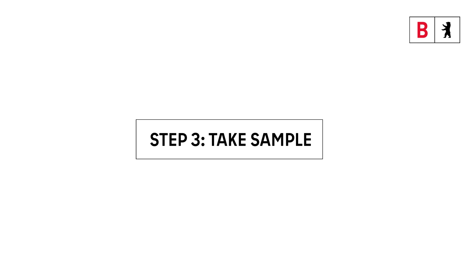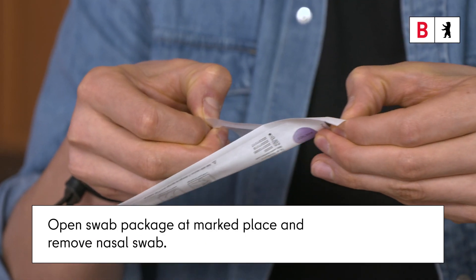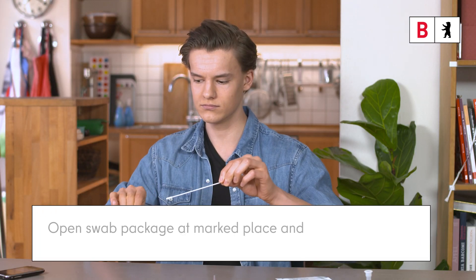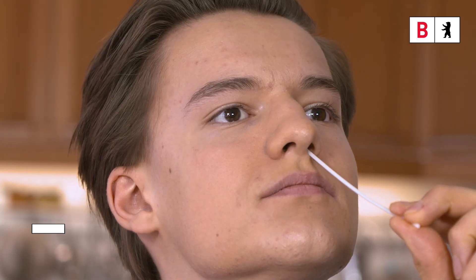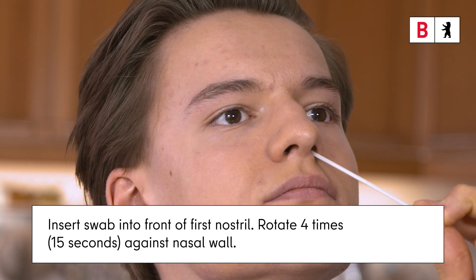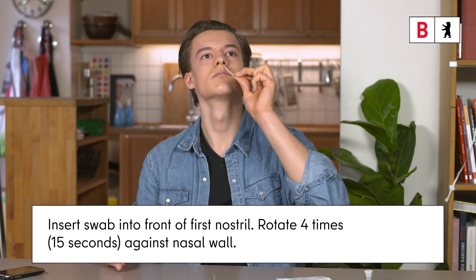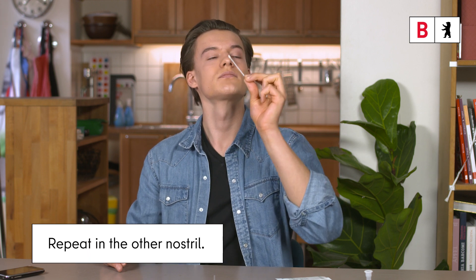Step 3. Collect the sample. Open the swab packaging at the marked place and remove the nasal swab. Tilt the head slightly back. Then insert the absorbent tip of the swab about 2 cm deep in the front part of the first nostril and rotate 4 times, i.e. for 15 seconds, against the wall of the nose. Now repeat the process in the other nostril.